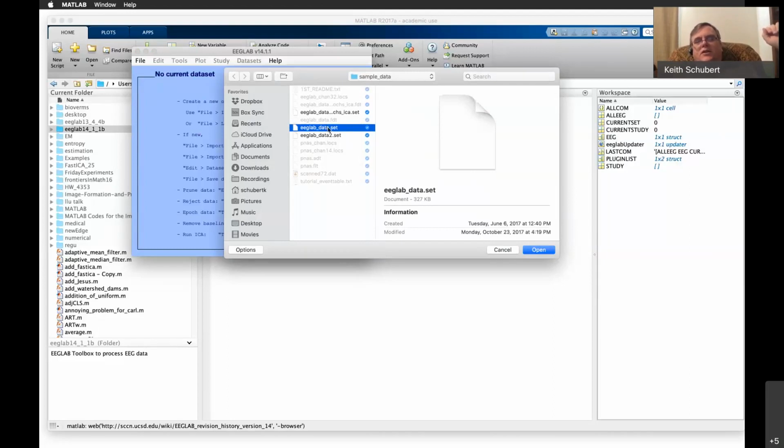For an awful lot of these, they can be measured at, you know, 256 hertz or even sometimes a kilohertz. Believe it or not, the little headset I was using is actually measuring at a kilohertz, a very fast signal.